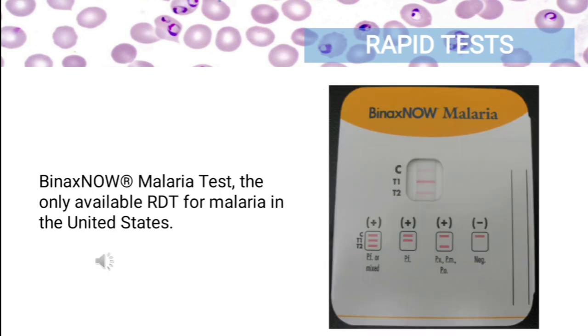Now, those tests mentioned earlier have low sensitivities for detecting infections with low levels of parasitemia, which is usually less than 100 parasites per microliter, and mature gametocytes. In contrast, trained microscopists can diagnose infections with parasitemias as low as 5 to 10 parasites per microliter. The reported specificities of these tests are high, which is greater than 90%. Early tests reported false positives due to cross-reactions with rheumatoid factor, but these issues have reportedly been addressed and corrected.